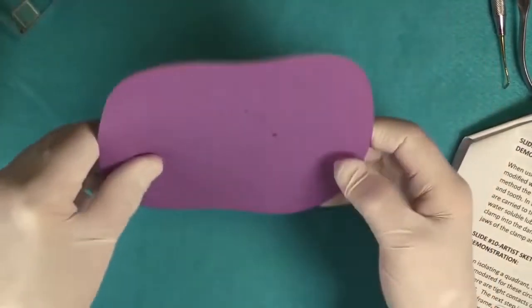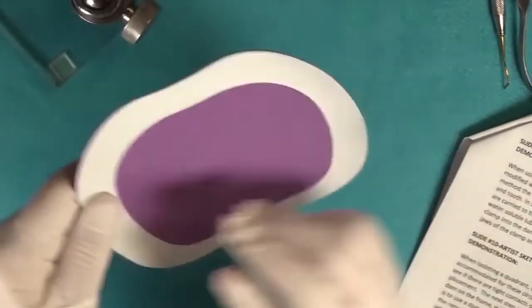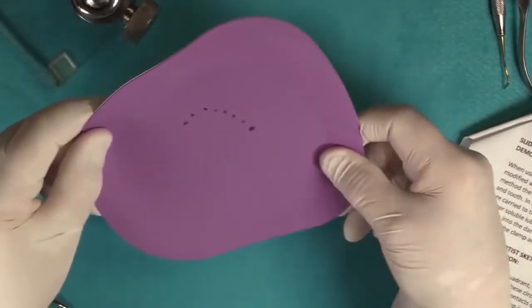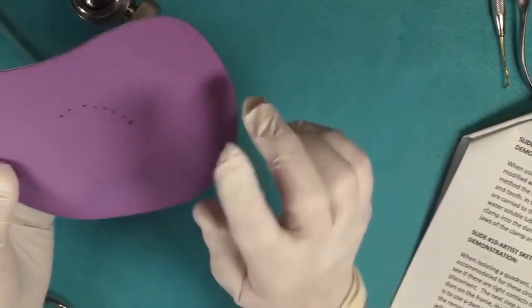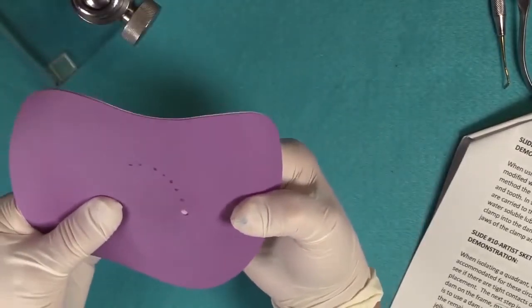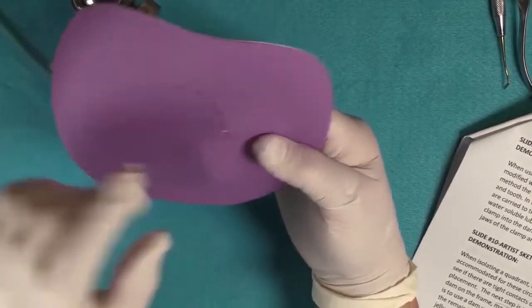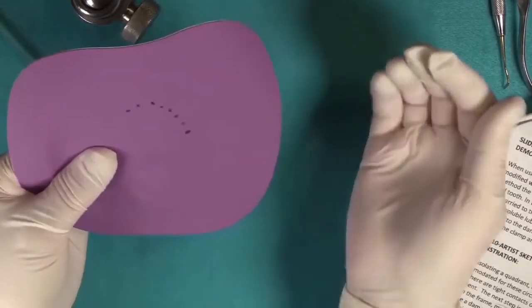Okay, we're going to use the framed dental dam, and when we're setting this up, by the way, it doesn't really matter if you have the frame showing here or here. Of course, it looks a little bit nicer when you have it this way. Now, when we're using a wing clamp, we don't want to use lubricant on this, which is called the keyhole. The hole that gets the wing clamp is called the keyhole. So you don't want to use lubricant on that hole because the dam will slip off of the wings.